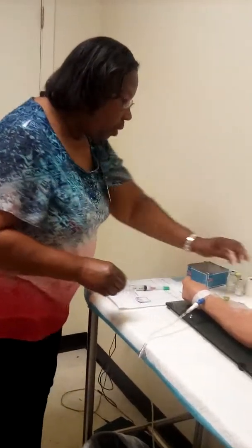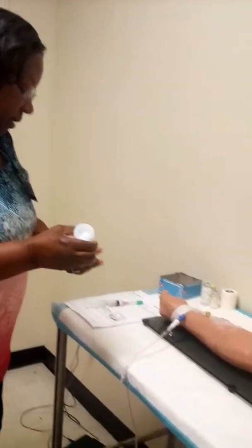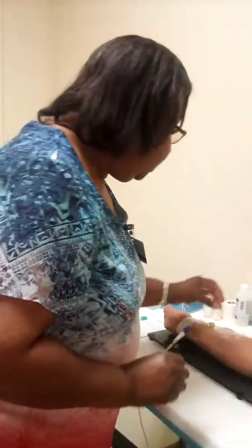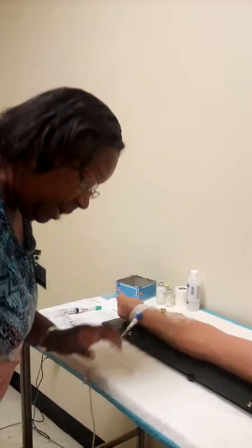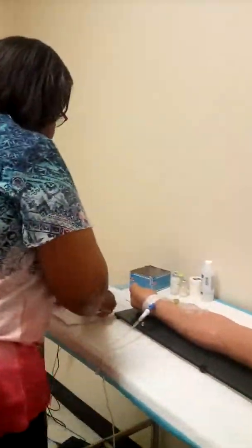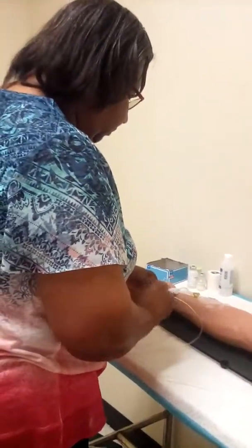I'm gonna wash my hands again. I'm gonna be checking the placement on the IV line. Monitoring the site, see if it has any redness or swelling or anything on it. It does not. I'm gonna drop my IV bag down to see if I get a blood return. And I do. The patient has D5W hanging, and it is compatible with the medication that I'm giving. I'm gonna scrub my hub for 15 seconds.